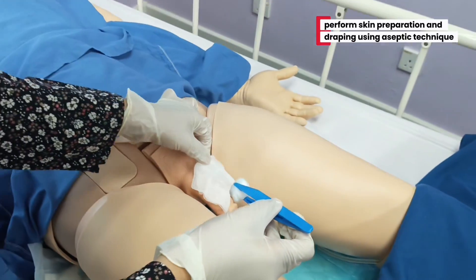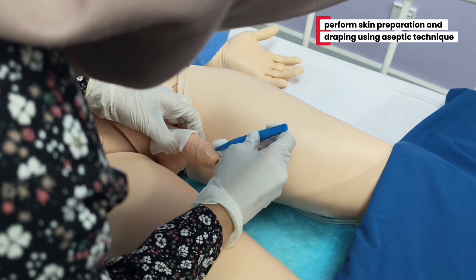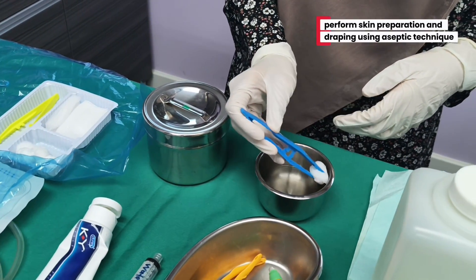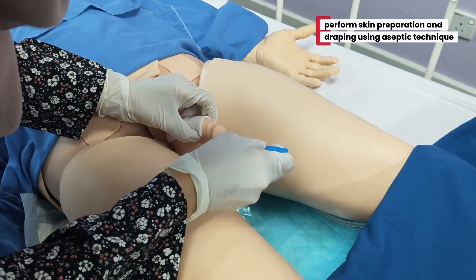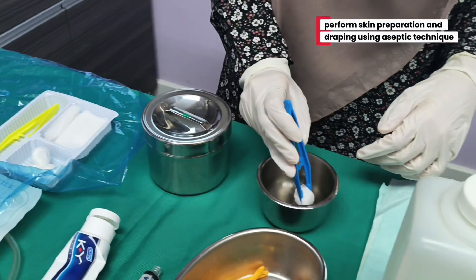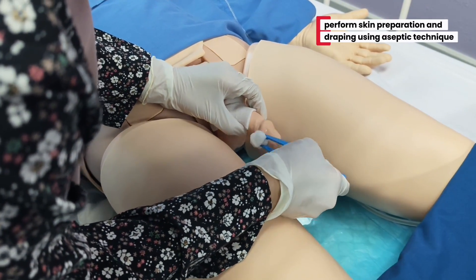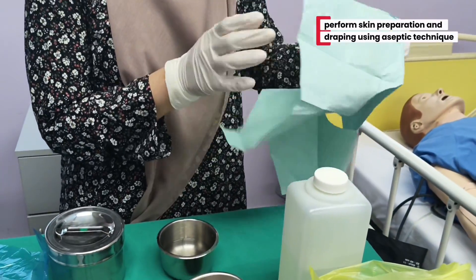I am going to put the plastic bag on the side. Thank you. Now I'm going to place the sterile drape to mark the sterile field.